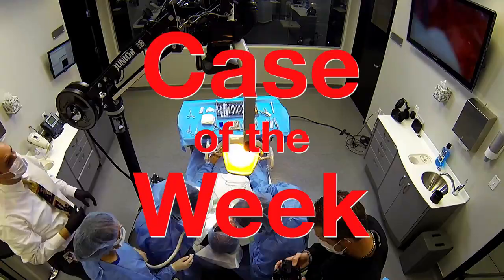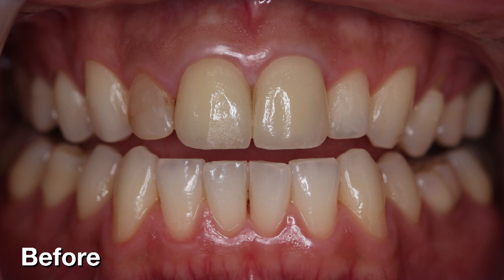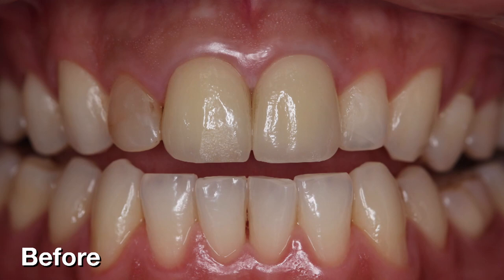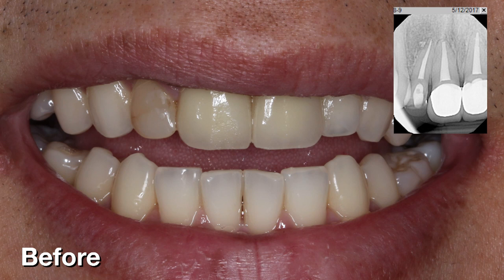Take it away, Dr. Marishan. Hello, and welcome back for my new Chair Side Live episode. I find today's case most interesting because it deals with the restoration of a facial trauma. For the outcome, I will seat and bind four Bruxer Anterior restorations simultaneously using a carrier tray. While running on a slippery swimming pool deck at age 11, he lost his footing and landed face first onto the concrete rim, catastrophically fracturing his central incisors. Three of his anterior teeth had to undergo root canal treatment.